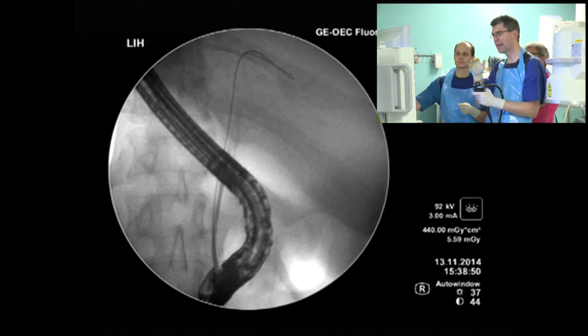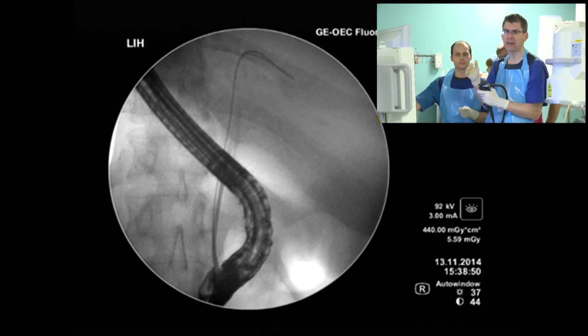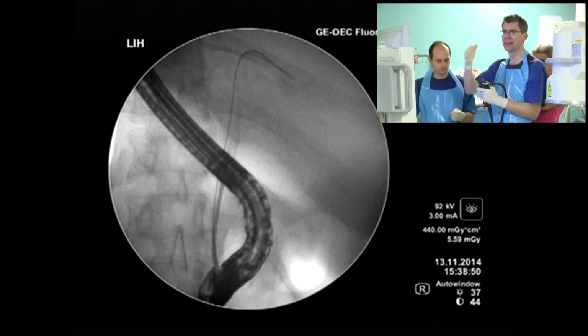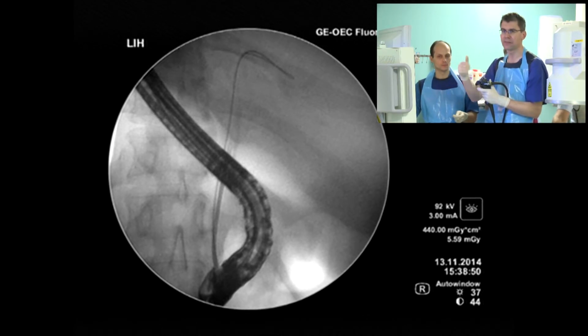This is by any standard not a full-blown PSC cholangiogram. We saw some changes, and we saw the MRI before, which gave us a good idea of what to expect. And always when you've seen the MRI, you've got an image in your mind which you compare to when you do the direct cholangiogram. This lady definitely needs follow-up.